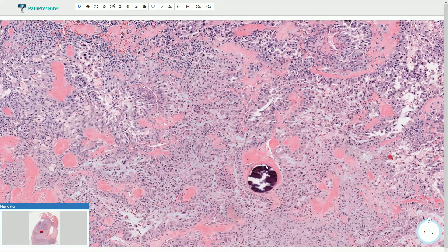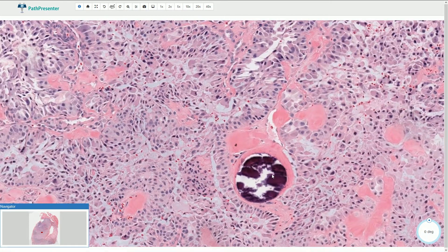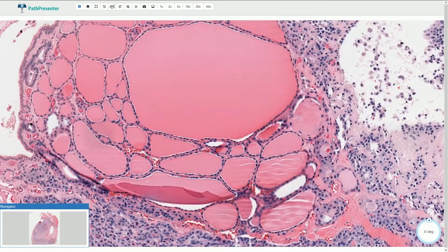Sometimes we can find calcifications that can resemble psammoma bodies, but we usually do not see the concentric lamination of these calcified foci. Sometimes we can also find infiltration of normal thyroid follicles by these neoplastic cells.